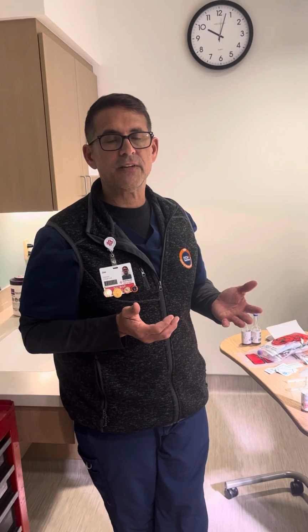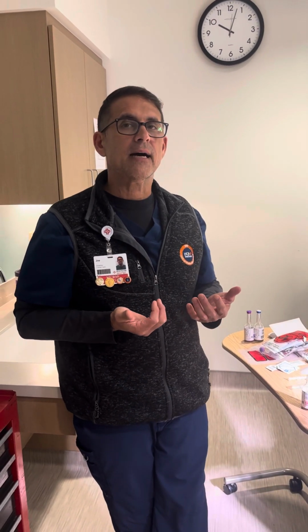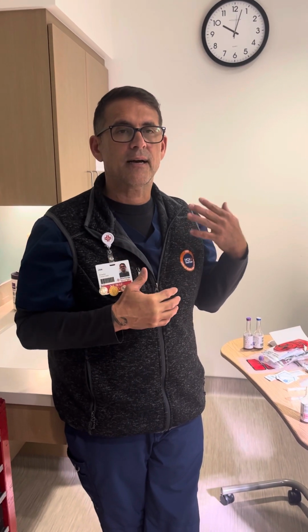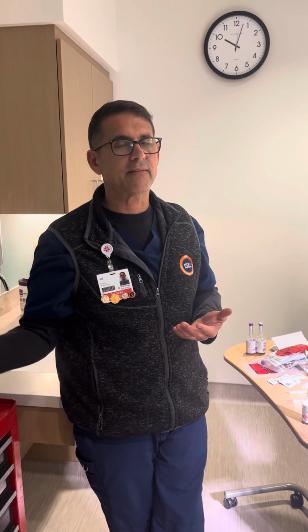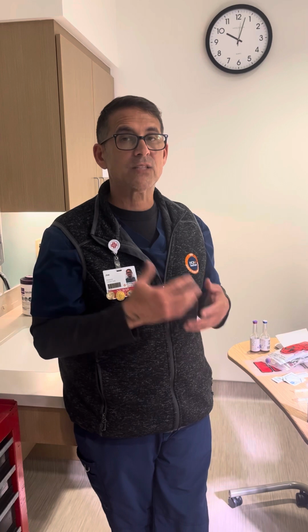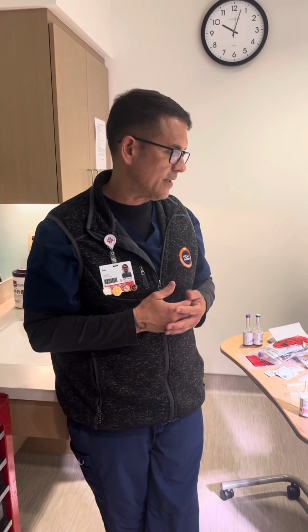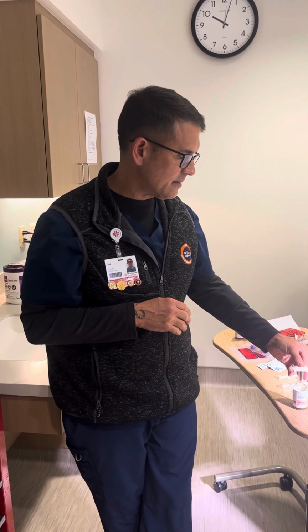Don't ever feel like you have to get the 2 sets to the point that you just draw blood from one place and you just fill all 4 bottles. That is not helping anyone. If you have to do 2 sets and you couldn't get enough blood, just do 1 set. Cancel the second set. But again, some kids, we really need to be getting that second set because it really helps with lowering your length of stay on kids that have a contaminant that are now having to be treated for 5 days with antibiotics when it was just a contaminant. That's what that second set does. It helps us avoid the length of stay, the cost, trouble for the patient and all that. So I think that's pretty clear.